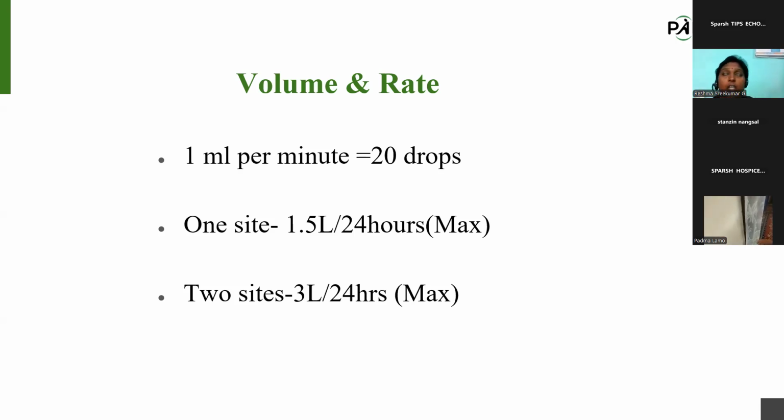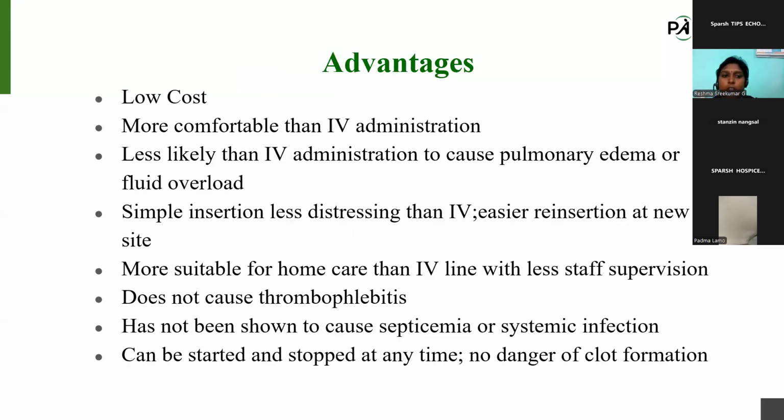It is very important. If we give more than 20 drops per minute, the patient may feel severe pain and there is a chance of leakage. The edema is more. So the volume and rate is very important in subcutaneous infusion.